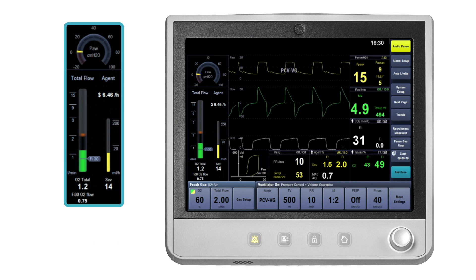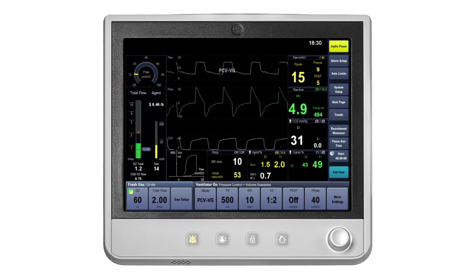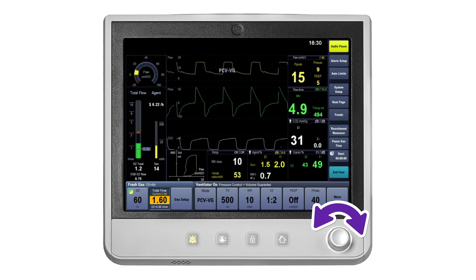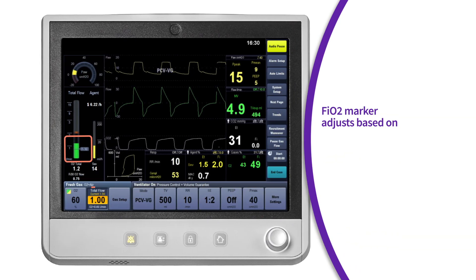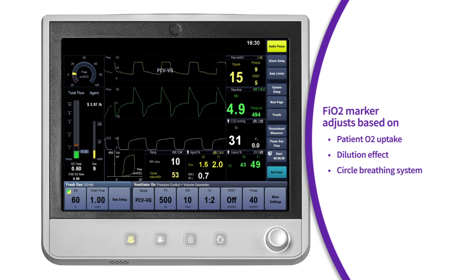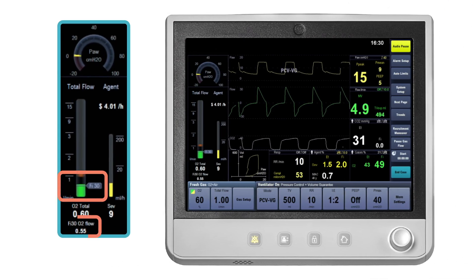When using the EcoFlow software, the total flow and/or O2 percent quick keys are utilized to adjust the O2 flow needed to achieve the FiO2 indicated on the FiO2 marker. First, determine the total flow that you would like to deliver during the maintenance phase of the case. Pressing the total flow quick key will provide a quick pick list of individual flows or a combination of total flow and O2 percent. Select the desired flow from the quick pick list or use the comm wheel to dial in the desired flow. The FiO2 marker will adjust to reflect the change in the flow rate based on the patient's oxygen uptake, dilution effect, and the effects of the circle breathing system. Following the total flow change, look at the FiO2 marker on the flow tube and the FiO2 total flow setting. If the oxygen in fresh gas is still above the FiO2 marker, then further adjustments to the O2 percent may be needed.